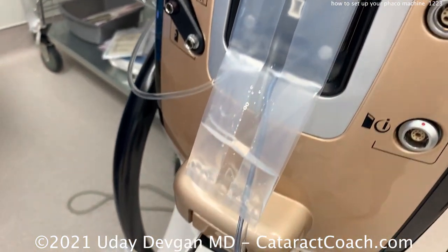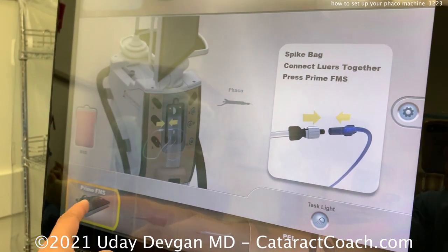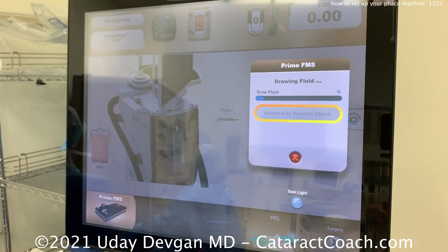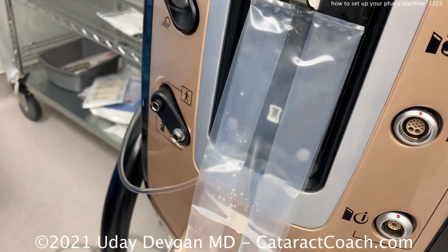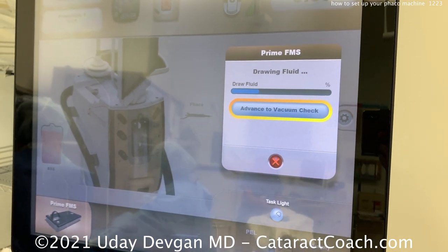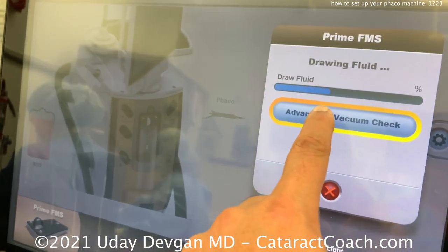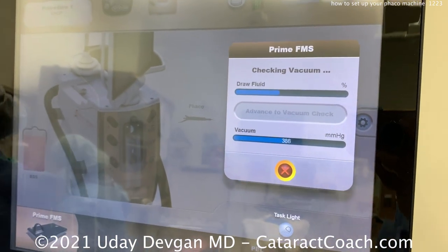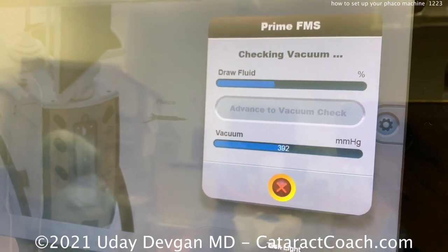The machine will do this and tell you when it's ready. When it's ready, we can advance to the vacuum check. You can see a little bit of fluid going there in that bag — now we prime the machine and it draws in the fluid. This is proprietary to this Centurion machine, but all machines run similarly. Now you know it's a peristaltic machine — we've talked about the difference between venturi pumps and peristaltic pumps, and you should be able to understand and use either one. We then advance to the vacuum check and it starts to check the vacuum.